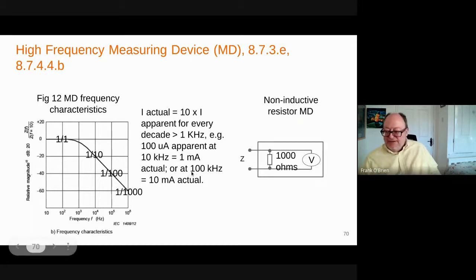Yeah, okay. It's 10 times the limit because it's 10 kilohertz. But anyway, it looked like 0.1. And then here you're going to measure it, and in fact, it was 1 milliamp, but the limit's 10, et cetera, et cetera. Anyway, you don't have to know that.